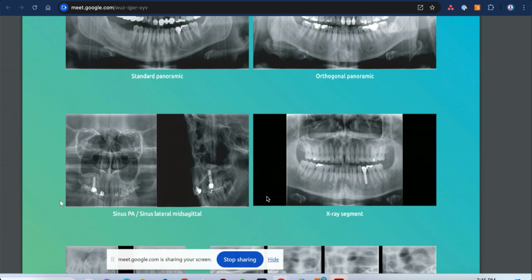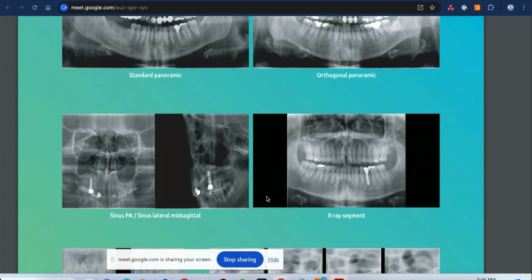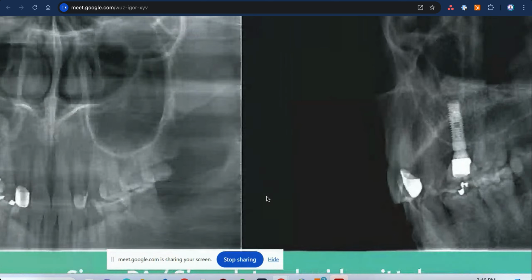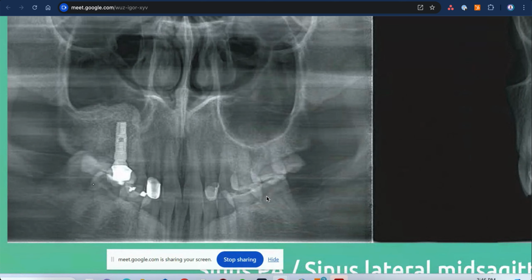Okay, there's a sinus, for example, in the case of sinus lifting here. Can you see the implant? Yes. Okay, great. As you can see here, there is definitely a sinus lift. Sinus lifting has been done, because the black shadow here means that this is air. Air in the X-ray appears as black. So this is the sinus, because it's an empty room. Here the dentist has done sinus lifting to elevate the sinus.